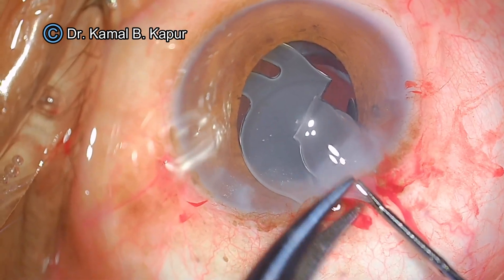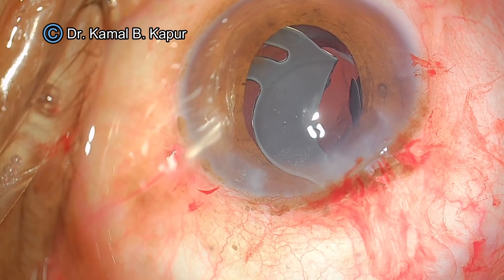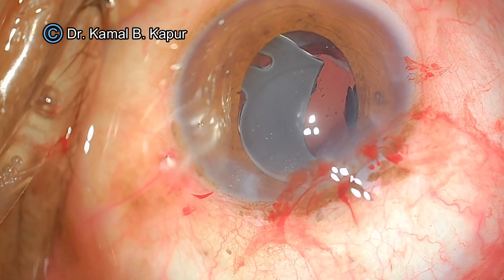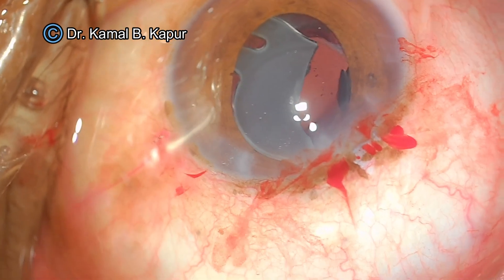You could actually cut this into three pieces and would not need to extend the wound, but I did not want to cause more trauma to this delicate patient. So I extended the wound. The IOL halves come out beautifully — the first half is out.